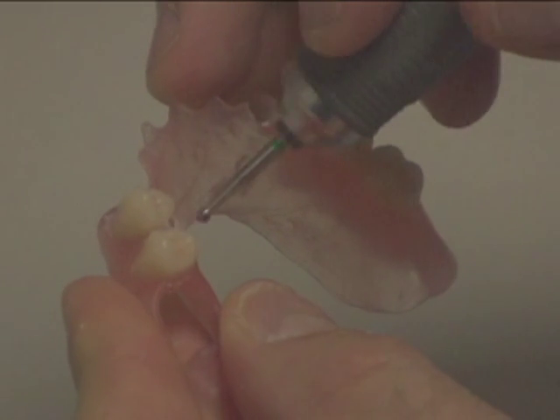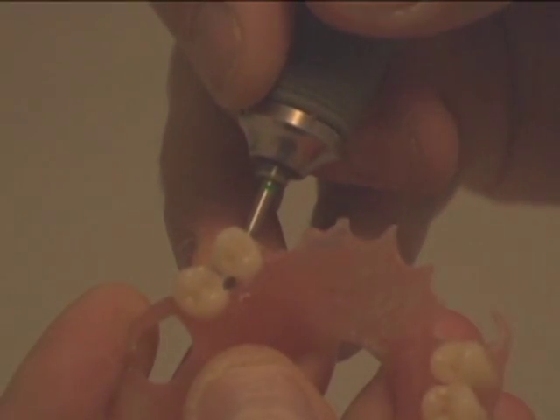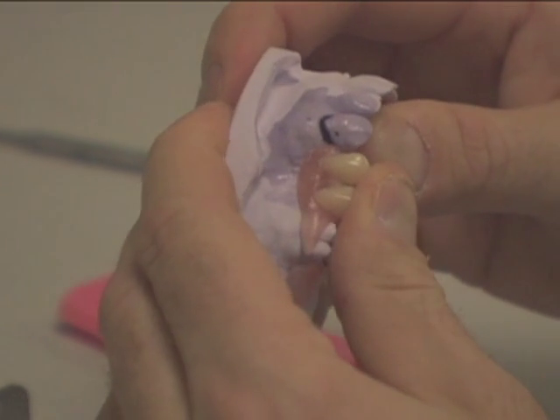At this time, drill the hole through the marked partial with a number 8, 2mm burr.